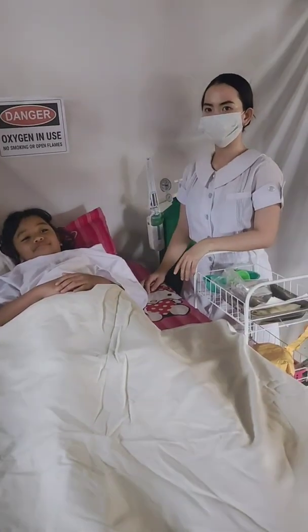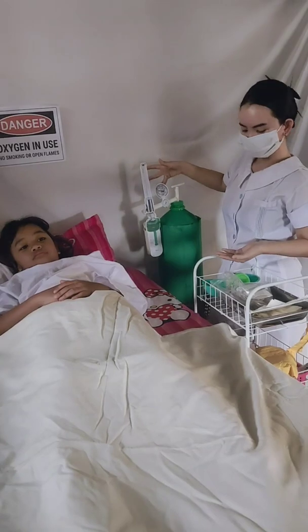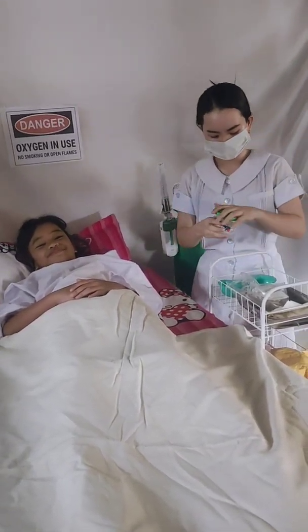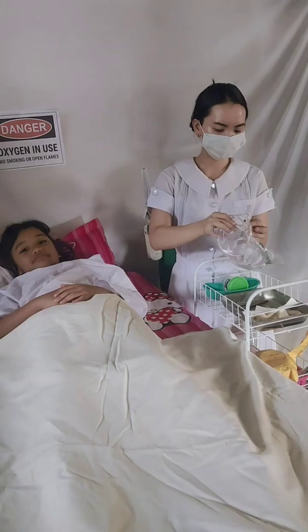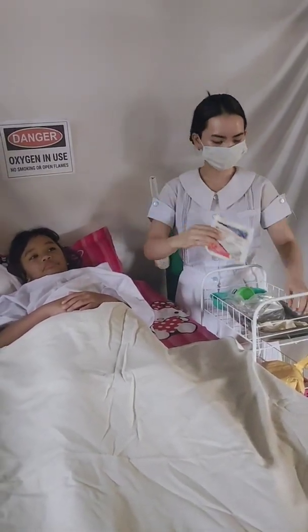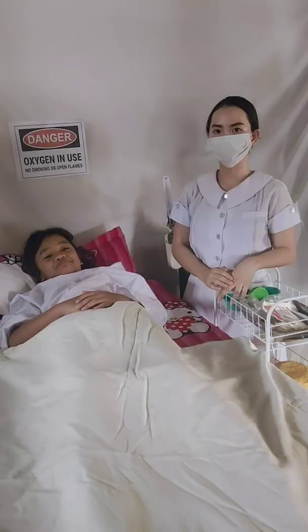Next are the equipment needed for the procedure. Oxygen tank supply with humidifier and water, and of course the flow meter. Next is the tape. This is for the proper placement of tubing. And then the nasal cannula tubing with appropriate size. And then the gauze pad. This is to lessen skin breakdown. And a no smoking sign for safety purposes.